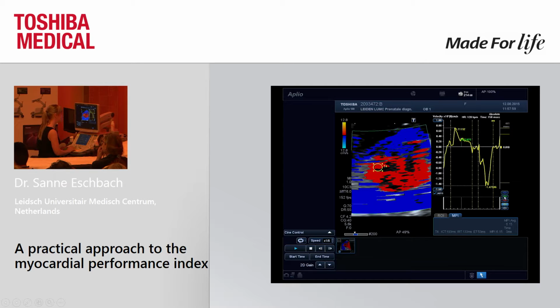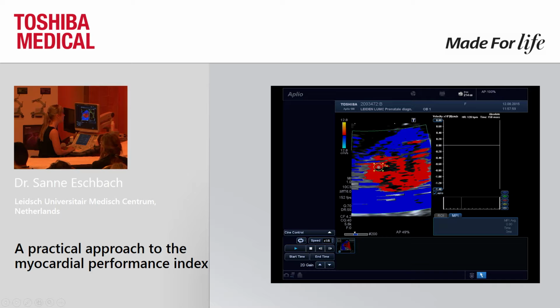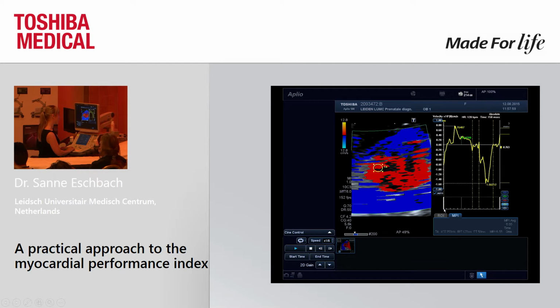And then, as I said, it could be more difficult on the right and the left side, so you just try to find the spots where you can find the demarcations of the relaxation and contraction time. It is more difficult, but this is clearly the relaxation time, which is shorter. And here's the end of the contraction time. And it's more difficult to define where it is here. So we can change the region of interest a little bit more.